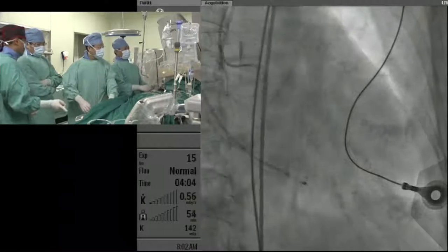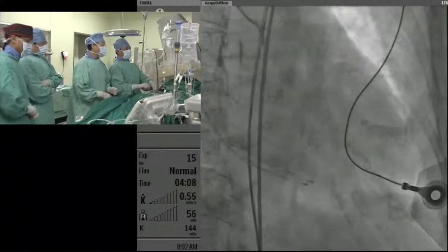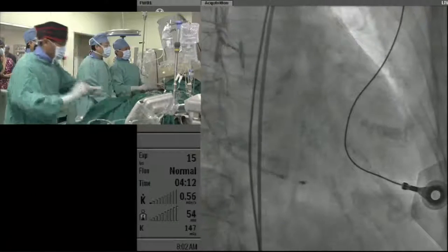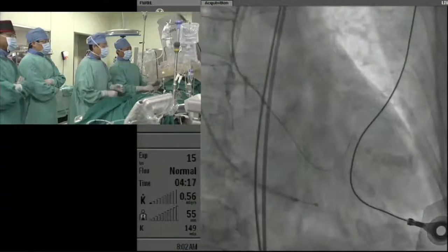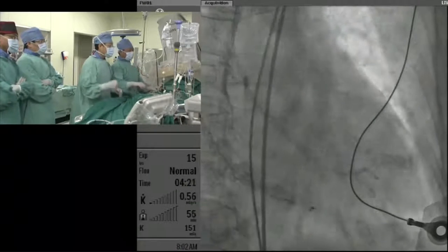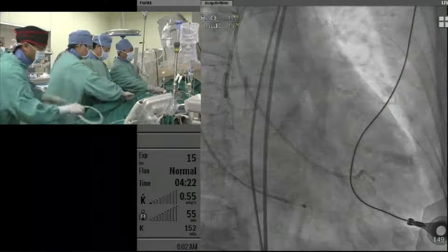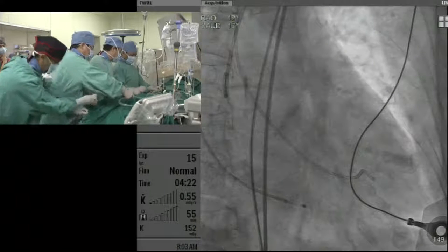I'm not sure anybody has been getting access using ultrasound, because sometimes with femoral vessel calcification, the location is very difficult to know from CT and so forth. We've been doing access now, and ultrasound clearly finds the vessel. We really never give up because of calcification with ProGlide, because with directed puncture you can usually get access.